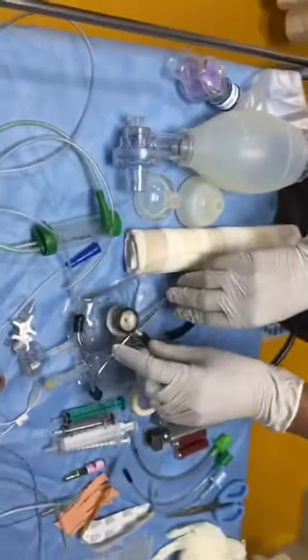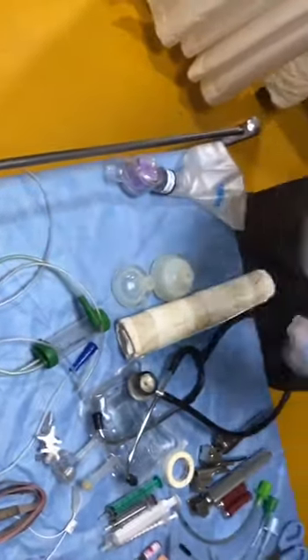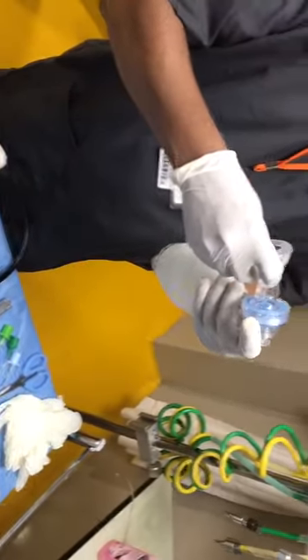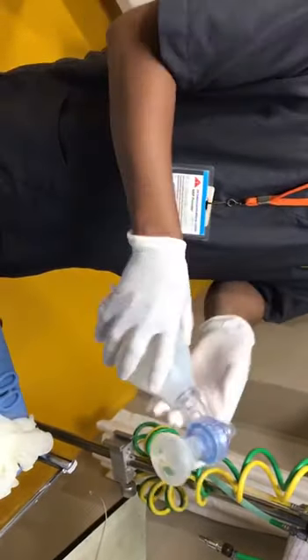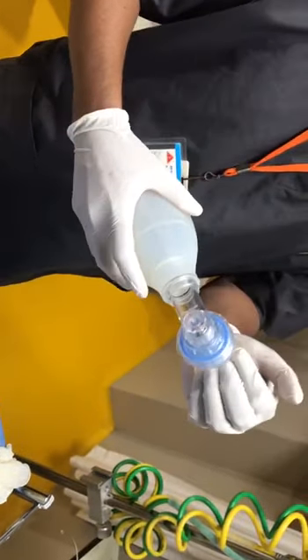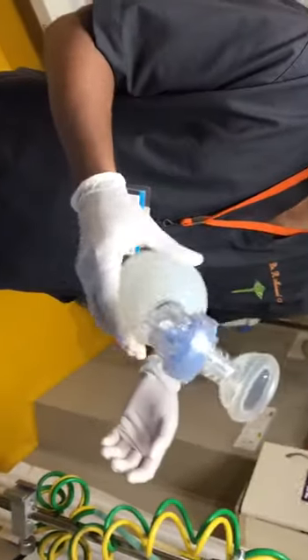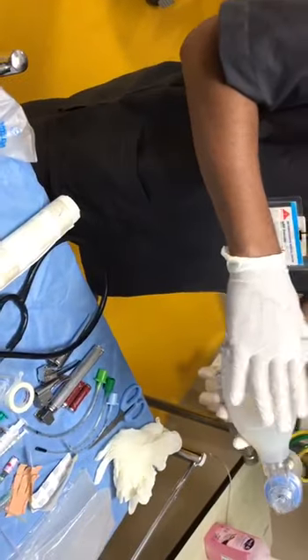Yes, good, fine. And for ventilation, I have the ambu bag. It's going to be a preterm, so I would like to use the preterm mask. Let us see how it is working. I would like to keep it ready. So I can feel the pressure in my palm. It's fine. Pop-off valve is working. And it is self-inflating. So hopefully it is in working condition.